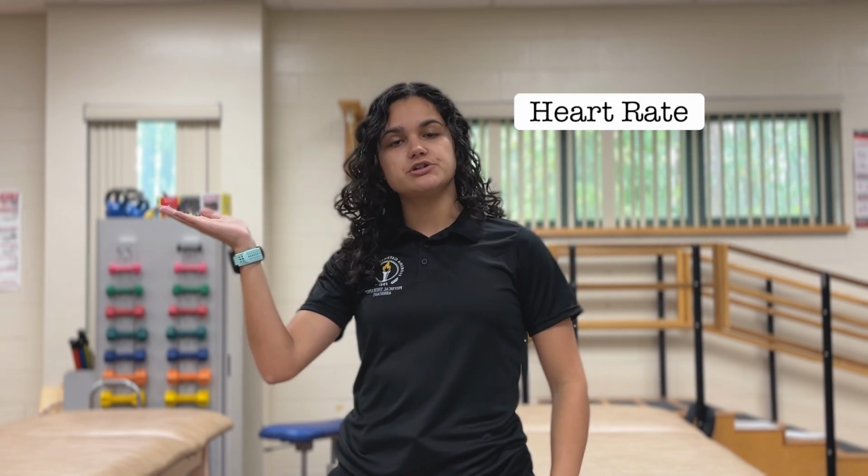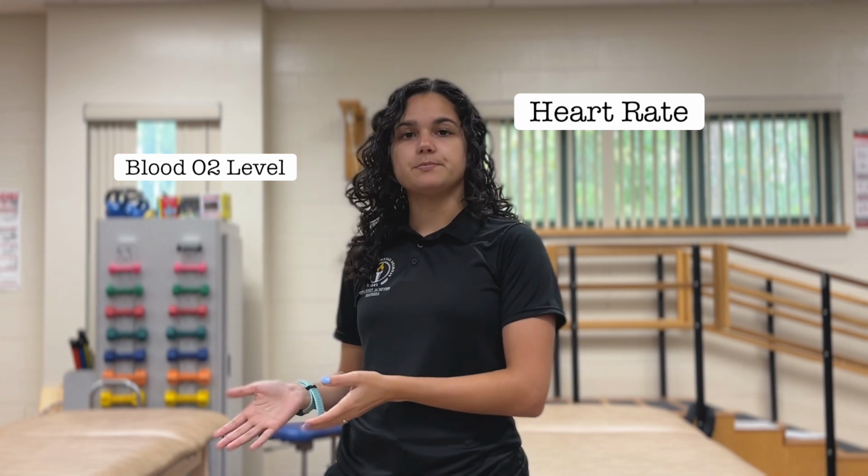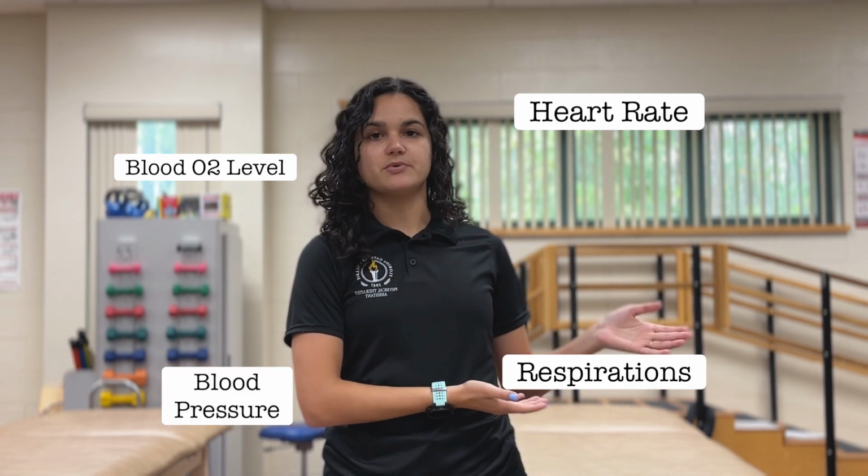Today from Mr. Skella, we will be getting 4 vital signs. We'll be getting heart rate, blood oxygen levels, blood pressure, and respirations.